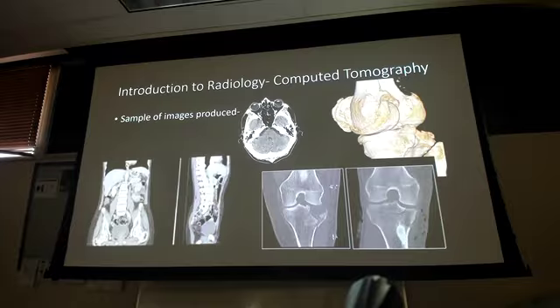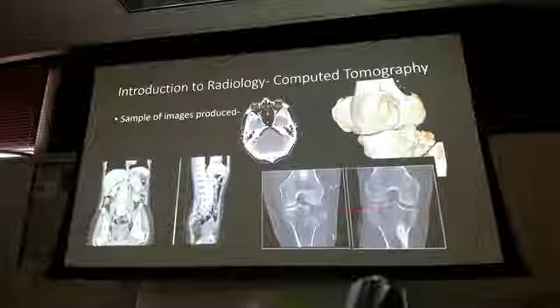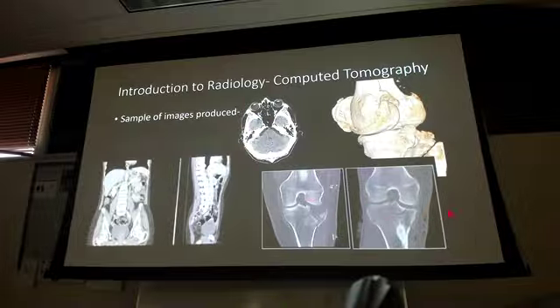Here we have a knee CT. Now we just talked about how x-ray for the most part is our musculoskeletal stuff, which is accurate, but sometimes in the area of major fractures, this can be really good for when they're going to go into surgery and fix this. See how detailed that fracture is, what is exactly involved. A lot of times ortho is going to want that prior to going in and doing surgery, so they have an idea what they're dealing with.